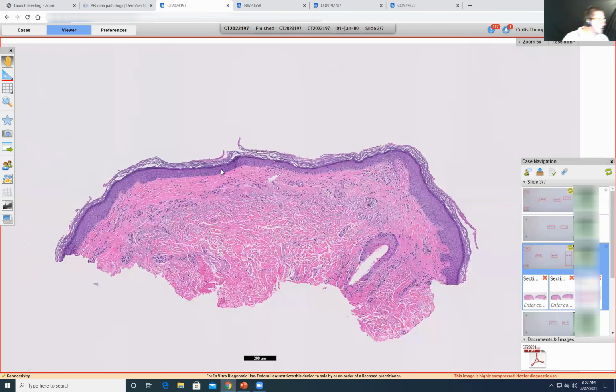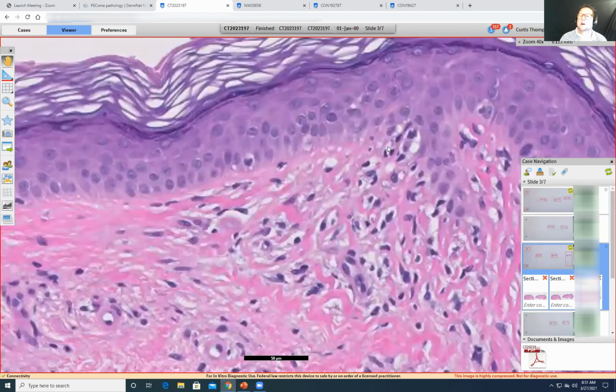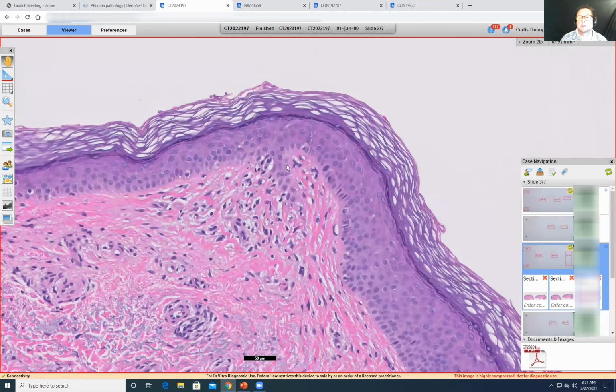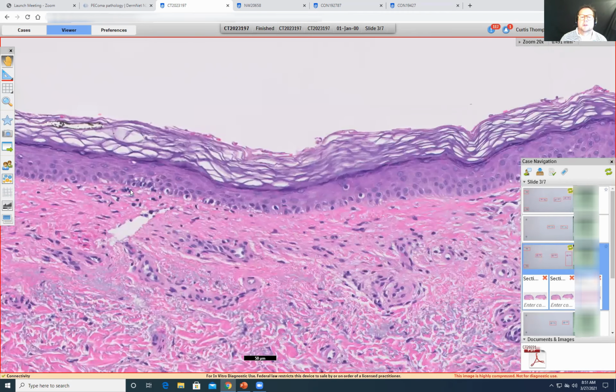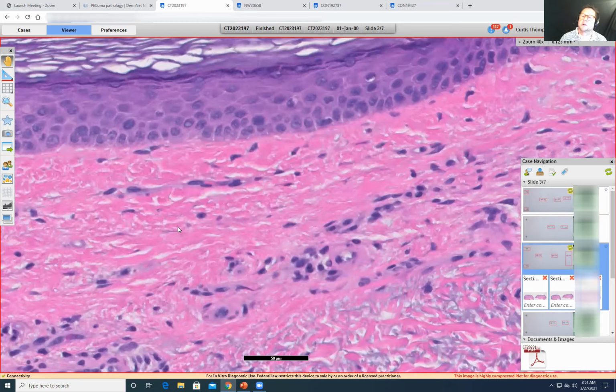them yourselves. So starting with case one, is a 52-year-old male, a rash, dermatosis, NOS, psoriasis, tinea corporis, lichen simplex chronicus. So here you can see the biopsy, some sun damage, a little bit of fibrosis here. And then what looks like interface here with some lymphocytes and maybe vacuolization of the basalis here a little bit more. And then are you wondering if those are lymphocytes or melanocytes?